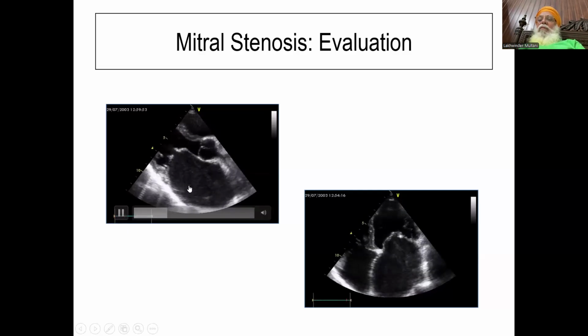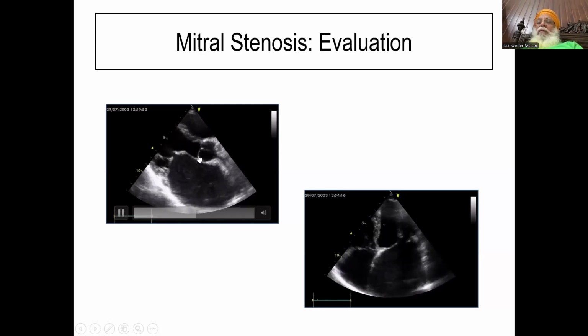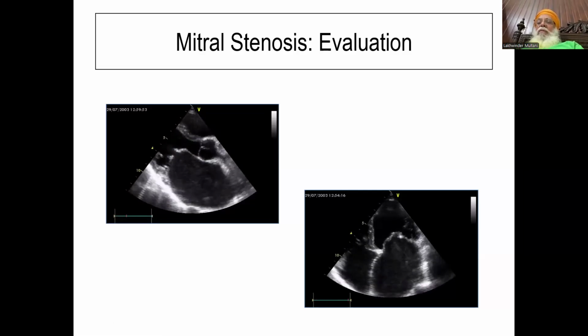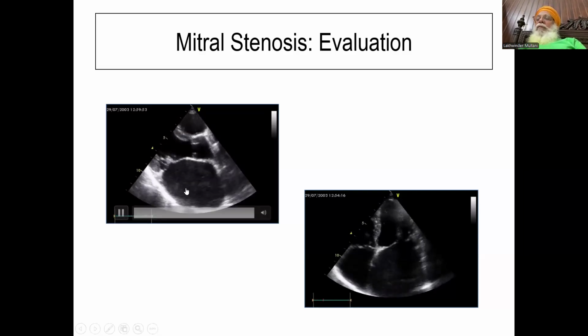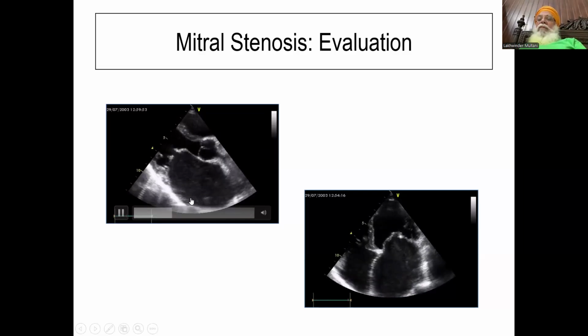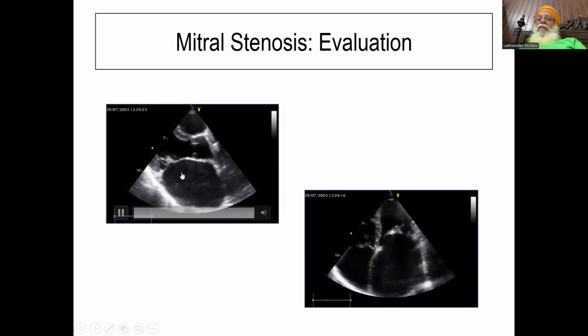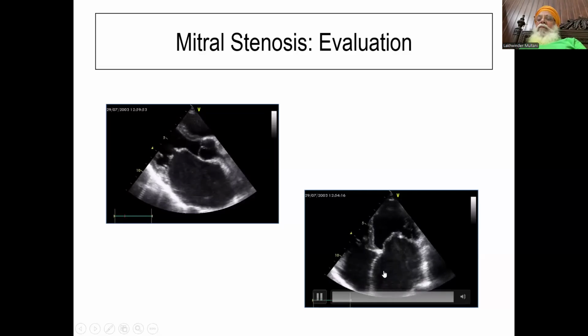Third important thing is, look at this aortic valve. The aortic valve looks to be thickened in this subset of patients. It means he belongs to that category of 20% of populations where aortic valves are also thickened. Most important thing is the spontaneous echo contrast in LA. Look at the LV, look at the LA, and you find lot many echo densities in left atrium because of the stagnation of flow. Here, the same thing can be seen over here.